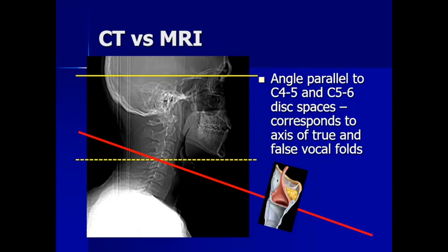Remember that with PET imaging, you don't have angled imaging, so don't try to talk about subsites of the larynx involved on PET scan.